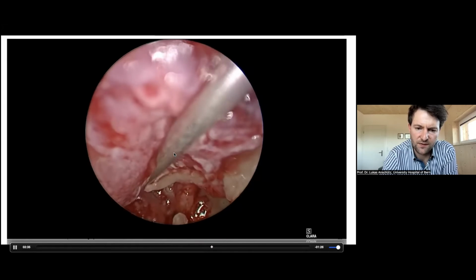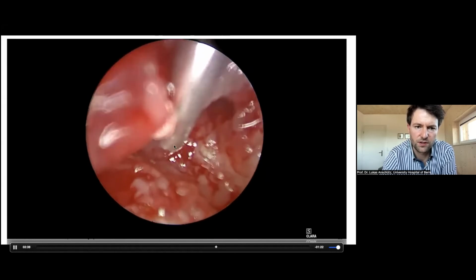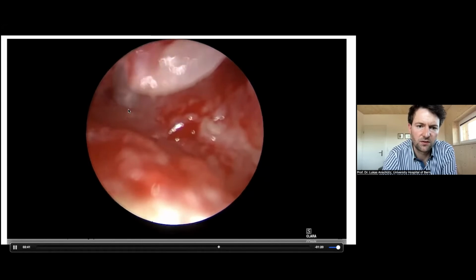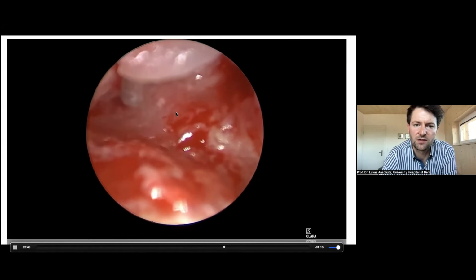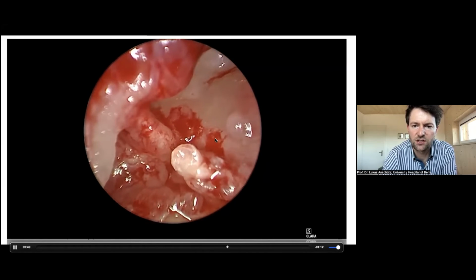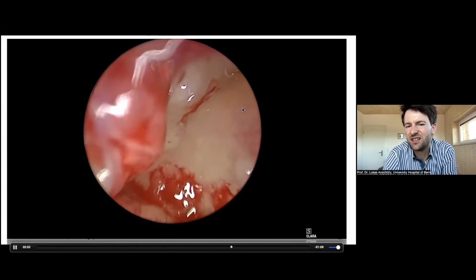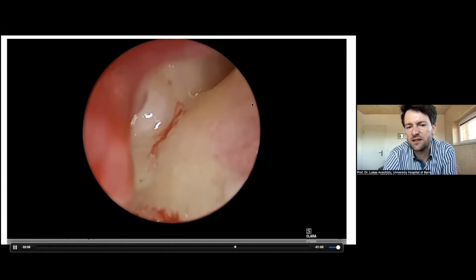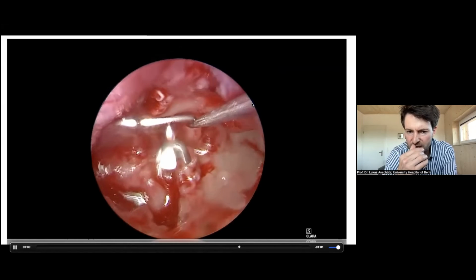And we can have a look at the Eustachian tube. You can see it here. Eustachian tube. I cannot really reach it with the suction, you can see, but I can see it. So it's quite nice. You saw I removed quite some of the granulation tissue, and with a 45-degree, I can look into the mastoid, and you can see there is some mucosal swelling inside the mastoid, but no cholesteatoma, nothing we really need to remove.